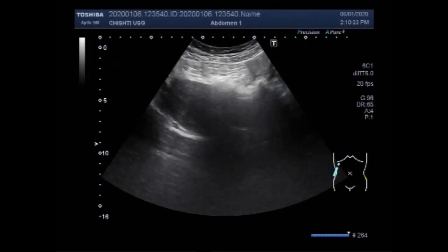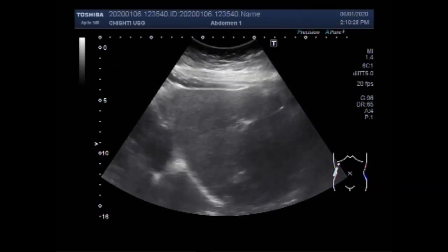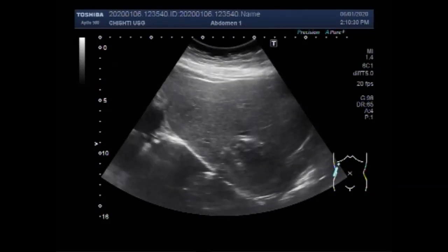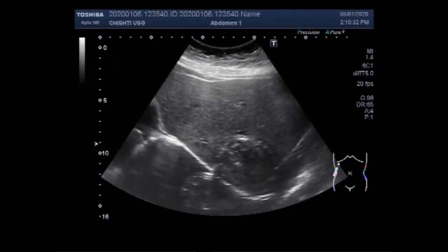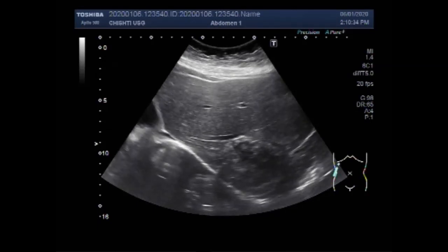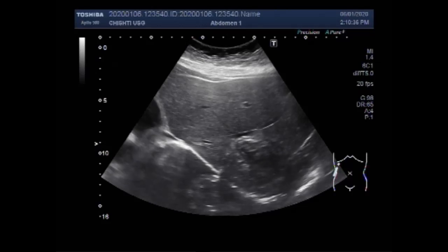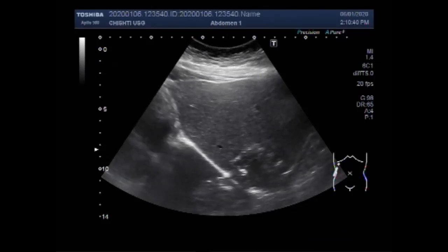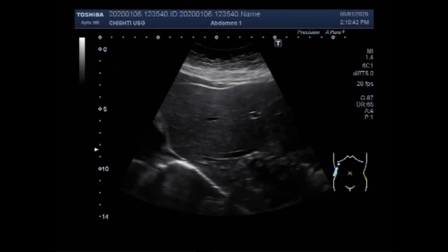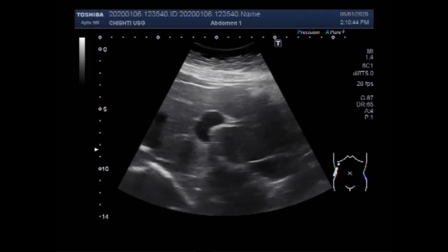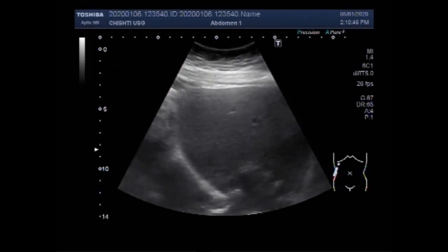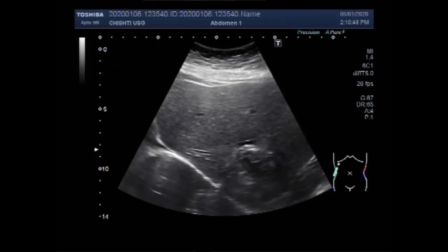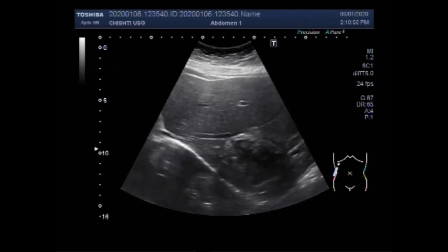Dear viewers, I hope you are all fine. This ultrasound video shows a hepatic hydatid disease, a parasitic zoonosis — a disease which can be transmitted to humans from animals. It is caused by Echinococcus tapeworm. In the liver, two agents are recognized as causing this disease in humans: Echinococcus granulosis and Echinococcus multilocaris.